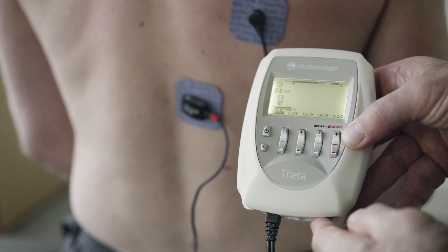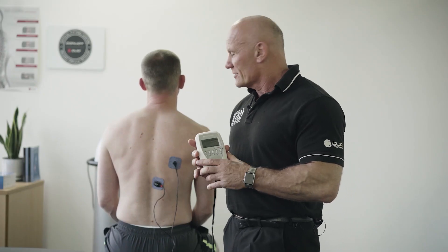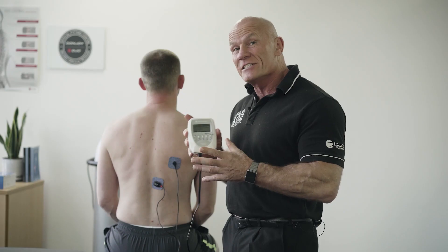Hi, so today we're looking at a tip on how we can use our Chattanooga Muscle Stim to encourage biofeedback and use it as an internal focus.